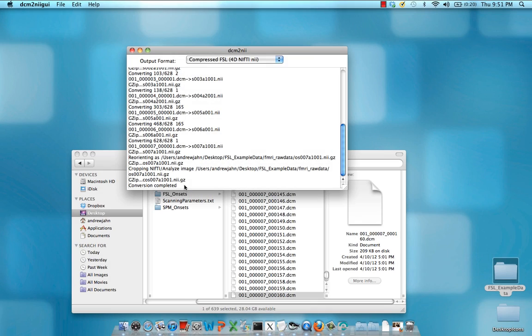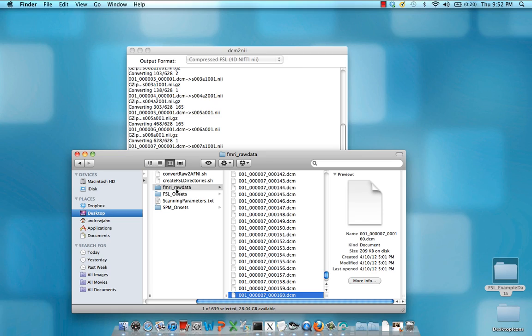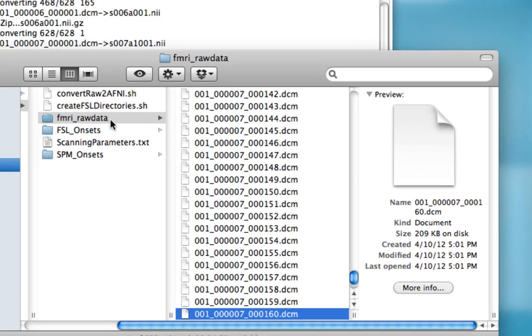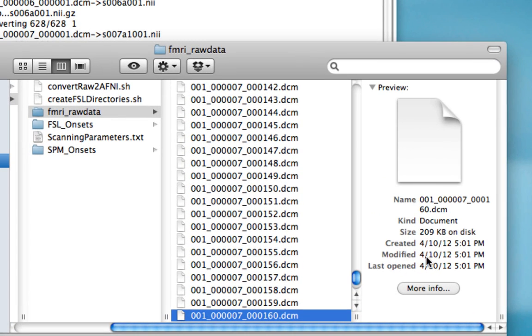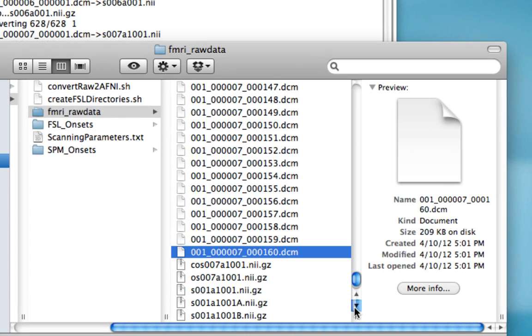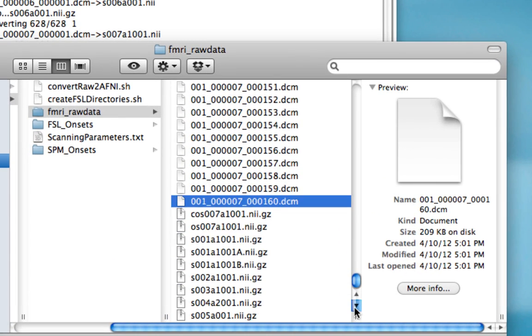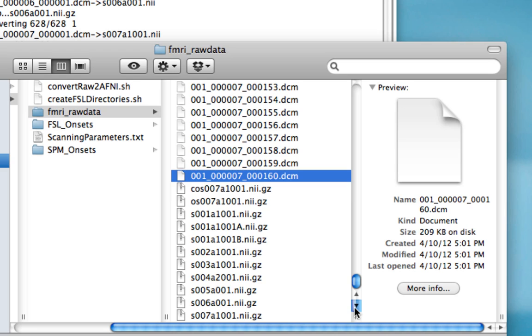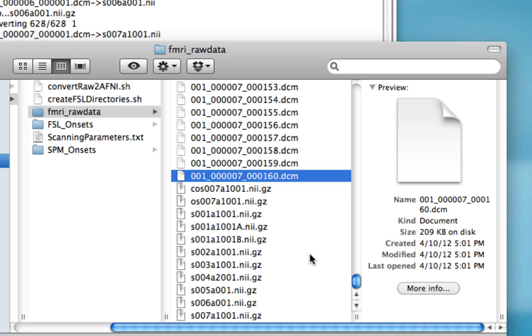After DICOM to NIFTI has finished converting, you'll see the conversion completed at the end of the text box. Let's go back to the fmri underscore raw data directory and look at what's been produced. Now we have NIFTI files, which have been converted from the DICOM files.